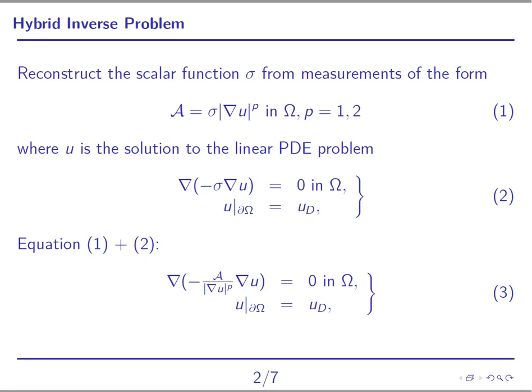The governing equation of the electrical fields is given in equation 2, which is an elliptic PDE in divergence form. If we substitute the power function measurement to the governing equation, we arrive at equation 3, which is a nonlinear PDE for electrical fields. In this talk, we restrict the boundary value only to the form of Dirichlet data.